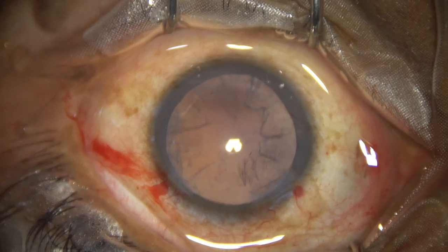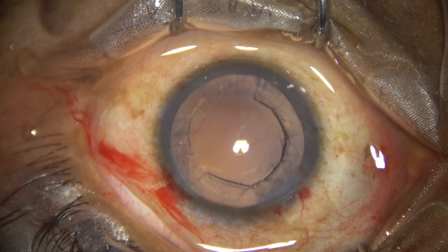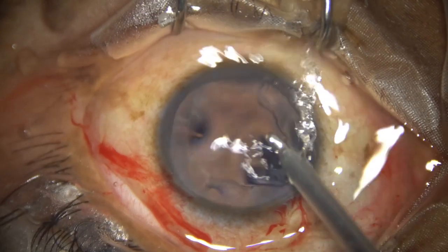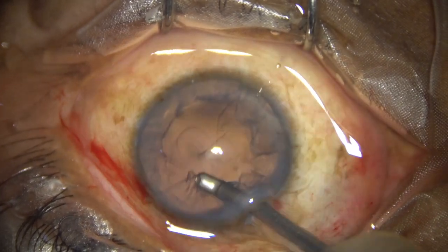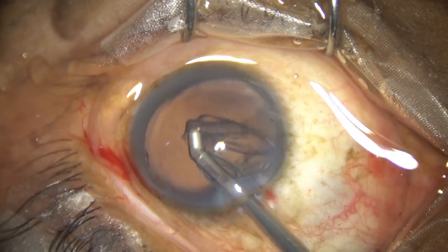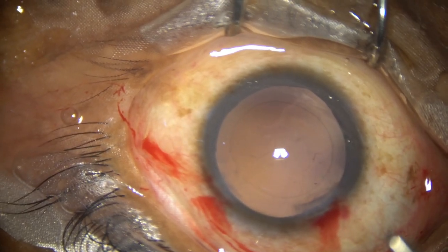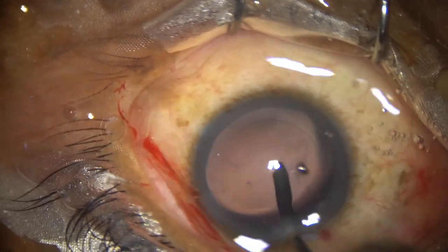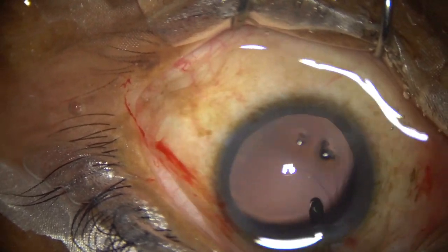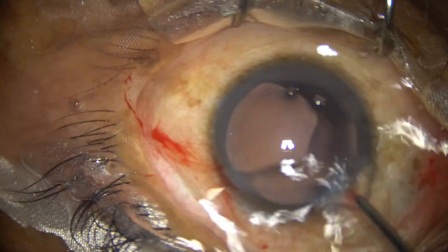The nucleus has been managed and the epinucleus has also come out. Now there is a lot of cortex in this case, and I am going to use a coaxial irrigation-aspiration from Oatley. The sub-incisional cortex is caught hold of first, and then the rest of the cortex is easily removed. Some cells sticking to the posterior capsule are addressed using only irrigation — the irrigating fluid is swept over the posterior capsule, the lens fibers get dislodged, and the posterior capsule is nicely polished.